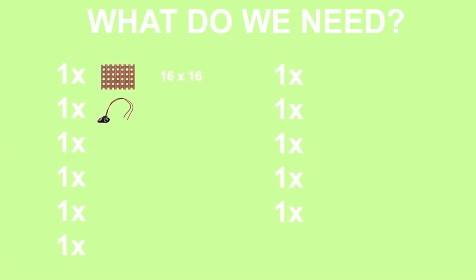In today's episode, we are going to look at how to make a DIY tDCS and what we need for it. So let's start with the circuit board that is 16 by 16, power supply, rechargeable battery, switch, transistor, then a trimmer that has a resistance of 100 ohms. It can also be a potentiometer, however you want to look at it, it's your choice. An LED diode, which is 2 milliamperes fully lit on.